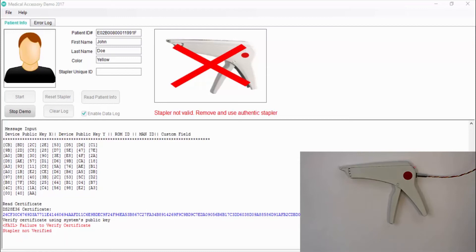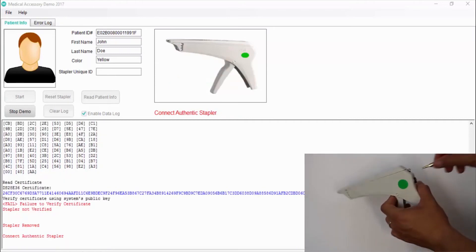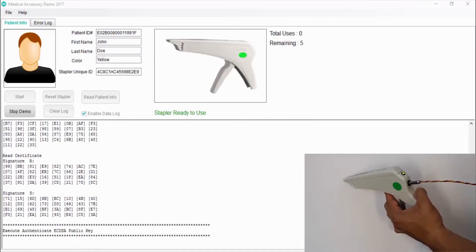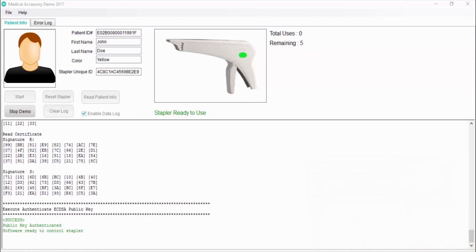To be able to operate the software and execute the treatment, it is necessary to use an authorized medical accessory. Now I will use the stapler with a green sticker that has a valid certificate and the correct set of keys specified by the manufacturer, and it is authorized for this application. Again, the software runs the authentication, and at this time the accessory is verified to be authentic and can be used for the treatment.